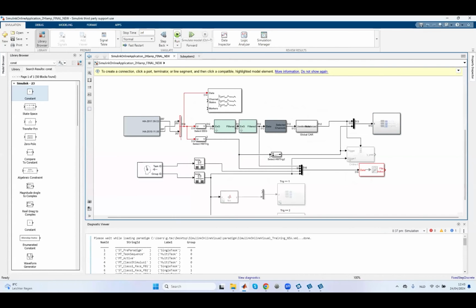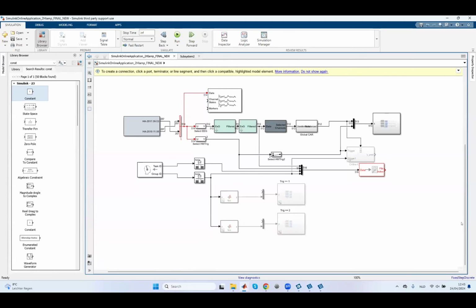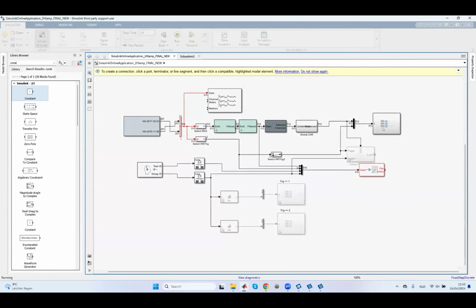Yeah, okay. So one of the other questions is, how do you know you're not classifying muscle artifacts? I think one important step is that you also visually inspect the data, and using these topographies you can also see if there's muscle contamination, but partly you can also filter this out by going to certain frequency bands.